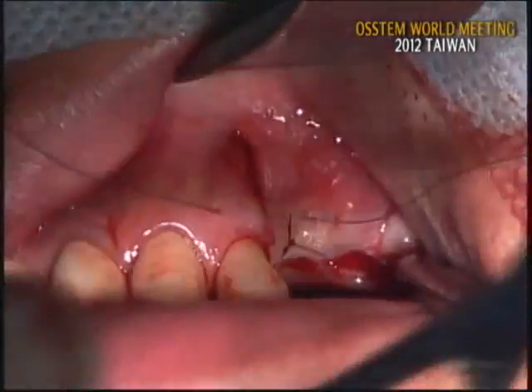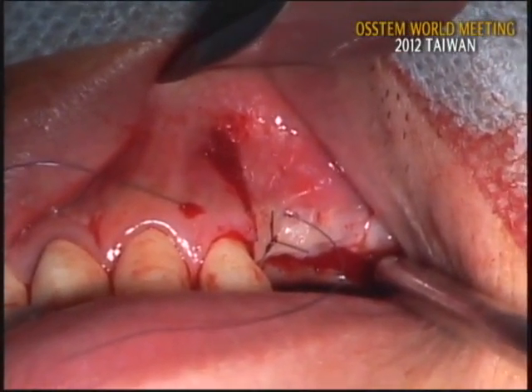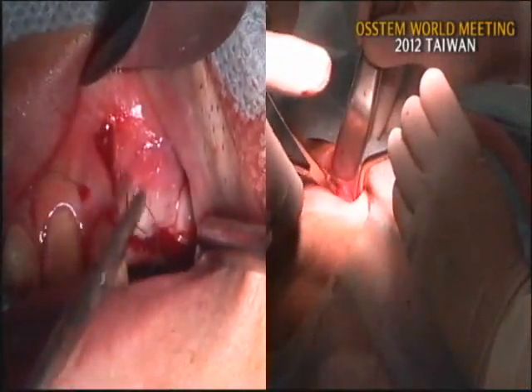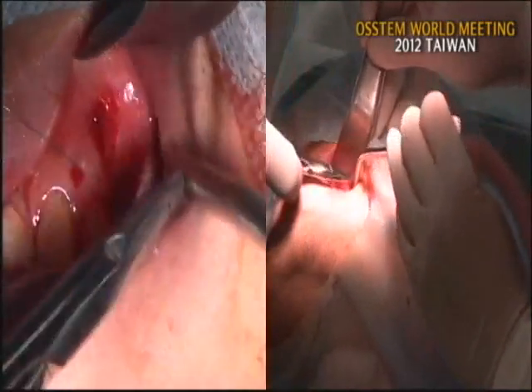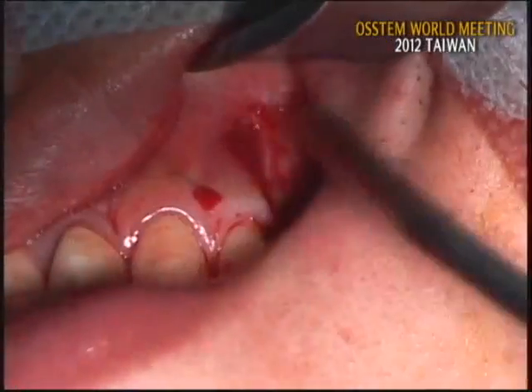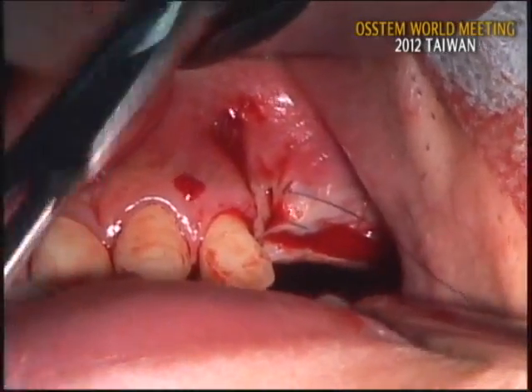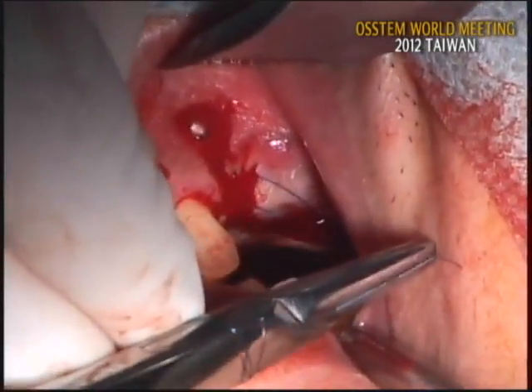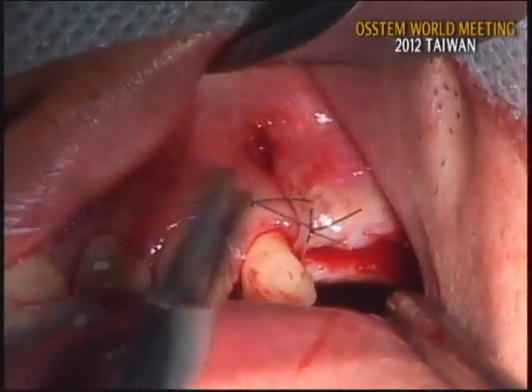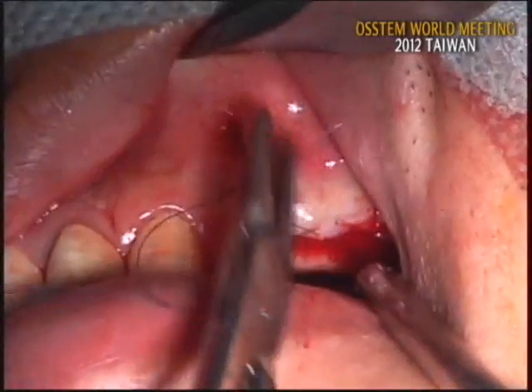During the suturing, hold the thread very close to the incision line like this. Do not hold the thread too long like this. This is not so good. Better is to hold very closely. And make a double clockwise rotation, pick up the end of the thread and tract this side. Then it does not easily loosen. Counterclockwise, clockwise.